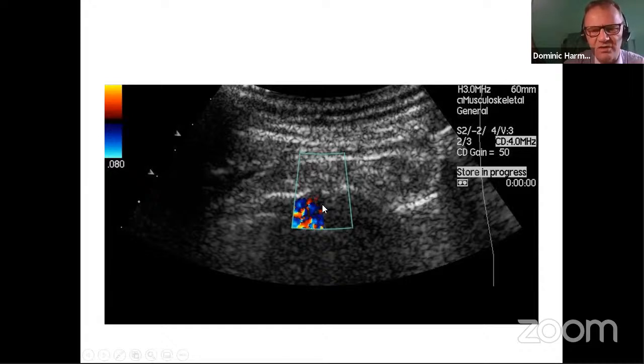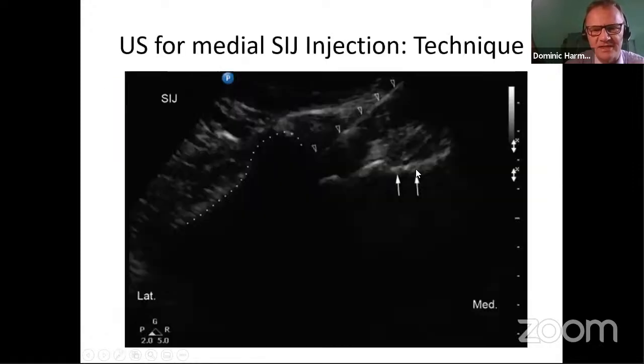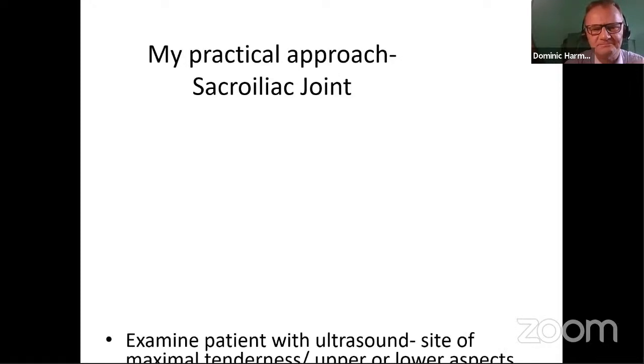Now, with virtually all sacroiliac joint injections, I will do the sacroiliac joint, but I virtually always actually take the needle out and aim more medially and inject some of the attachments to the joint at the same time. So here's an example whereby coming from medially, and so again, I have to disagree with that in terms of truly doing a sacroiliac joint, and we've done studies in terms of Doppler flow and confirming it with X-ray.